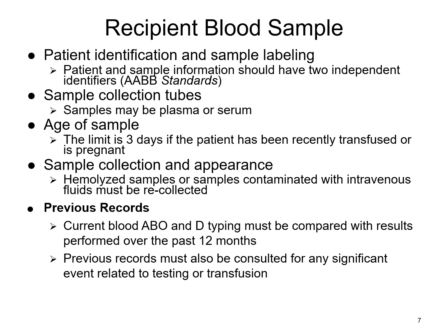Samples should not be contaminated with any sort of IV fluids, because those IV fluids are obviously going to dilute that specimen out. And I will make a mention too, it doesn't say it here, but clotted samples can sometimes cause issues. There's a little bit of fibrin that you can start to see if a sample's clotted.